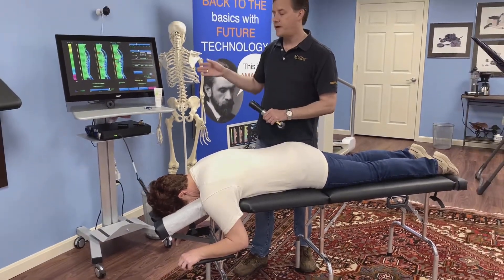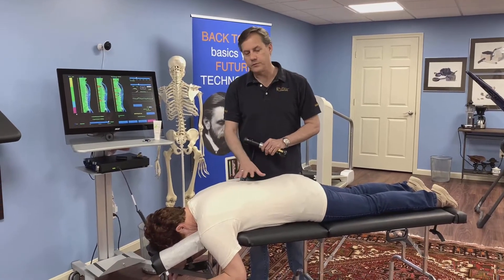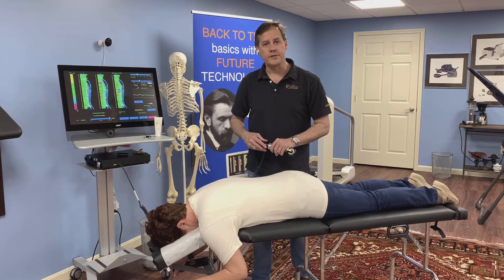You can use the myofascial mode or the point mode if you want to do trigger point work, and be able to relax some of those areas very quickly and easily, either before or after the adjustment.